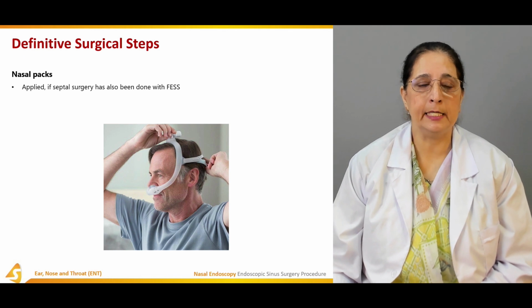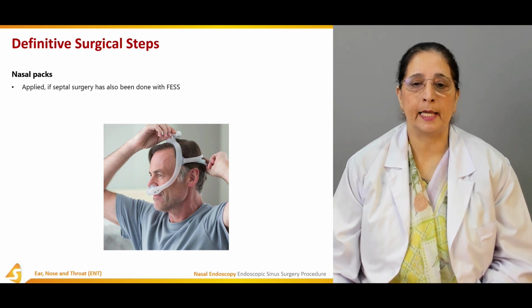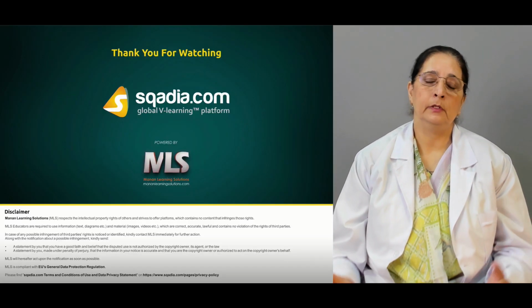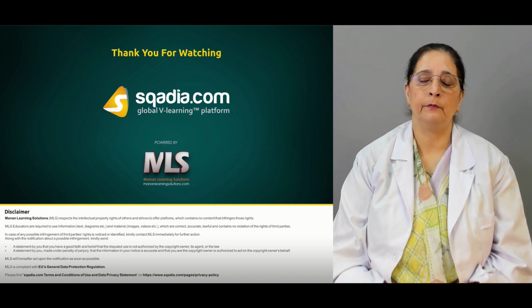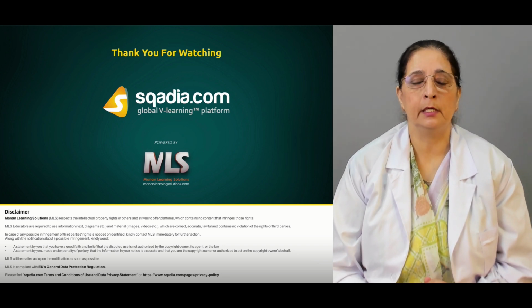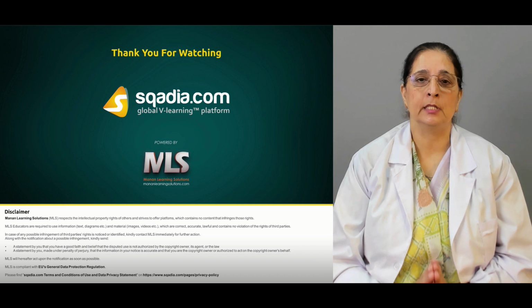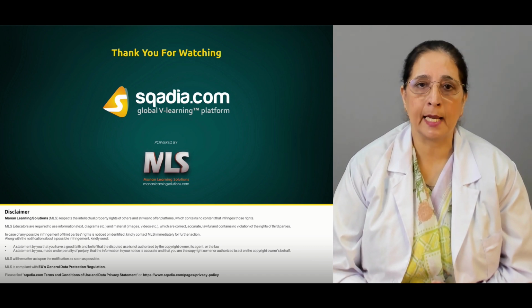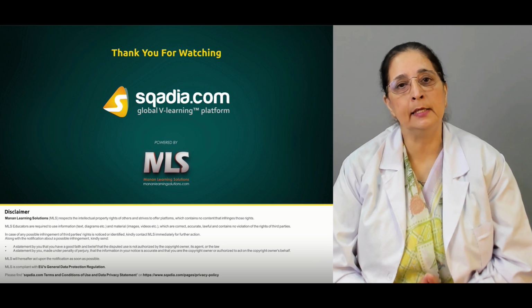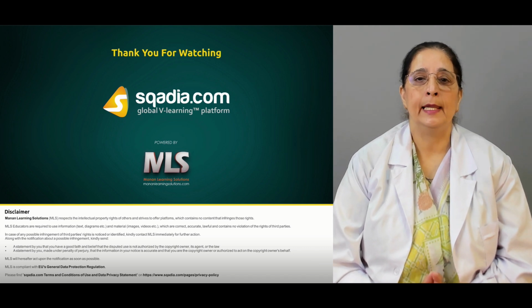Nasal packs are applied if septal surgery has also been done along with the sinus surgery, or to stop any bleeding from the nasal cavity. So this was all about the topic, which is nasal endoscopy, and we talked in detail about the nasal endoscopy procedure, and then indications, contraindications. Then we talked about the endoscopic sinus surgery, indications, contraindications, some major complications, minor complications, and then we talked about the steps of the procedure in detail.